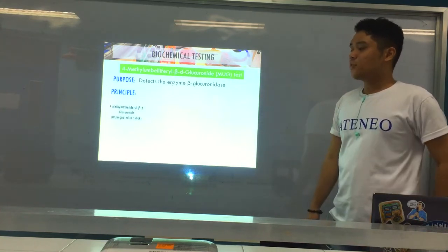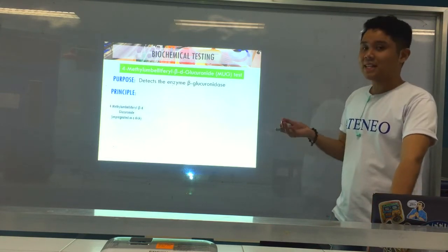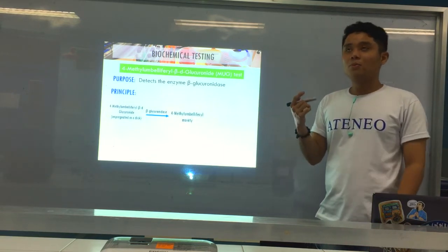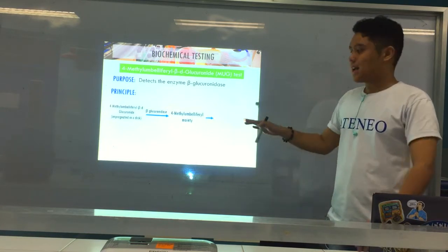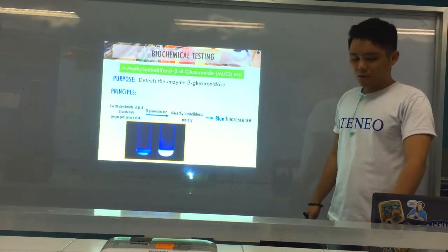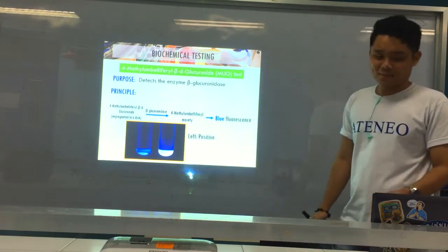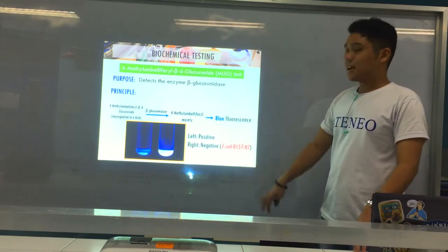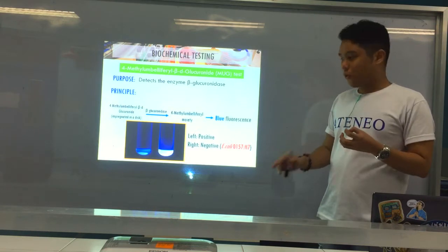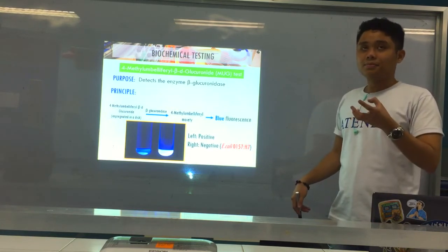The principle: the substrate, 4-methylumbelliferyl-beta-D-glucuronide, is found impregnated in a disc. In the presence of the enzyme beta-glucuronidase, it becomes a 4-methylumbelliferyl moiety. This emits a blue fluorescence. So the positive result is blue fluorescence. Here's an example — the positive is on the left, which appears blue, while the negative is on the right.